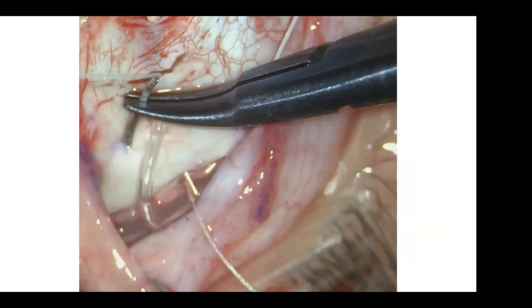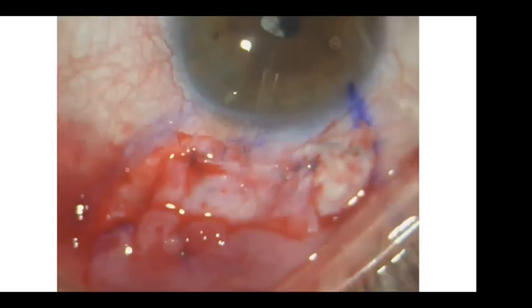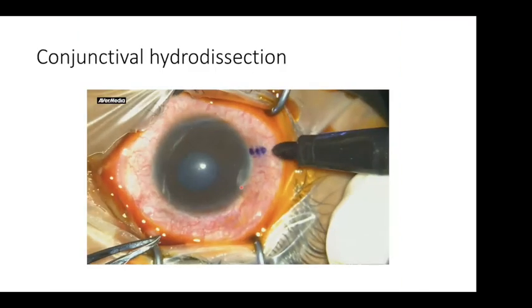In the old days, I used to push the valve and then put the scleral suture. Definitely, this is not easy. When you ask the scrub nurse all the time to push the valve posterior and then try to find space for the suture. That's why pre-placed sutures before putting the implant actually facilitated my life. Sometimes I close the tenons separately. When I have a thick tenon, I make use of it. I dissect it from the conjunctiva and I secure a separate layer of tenon on the valve.